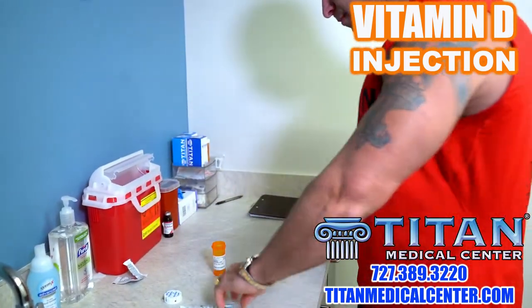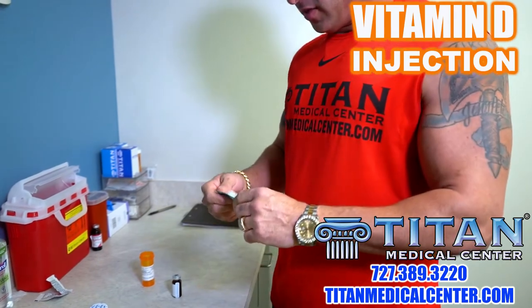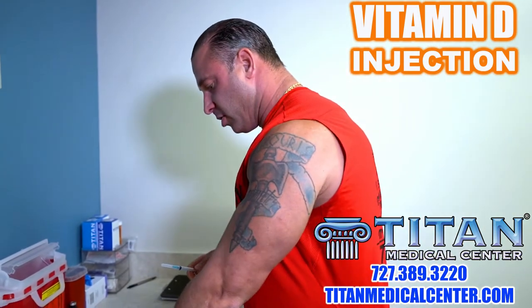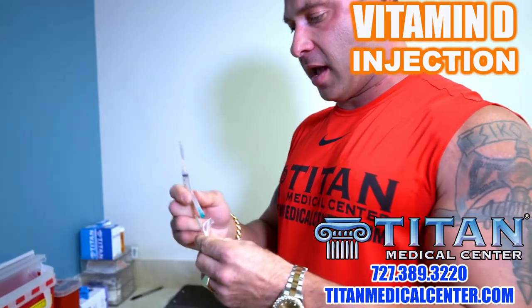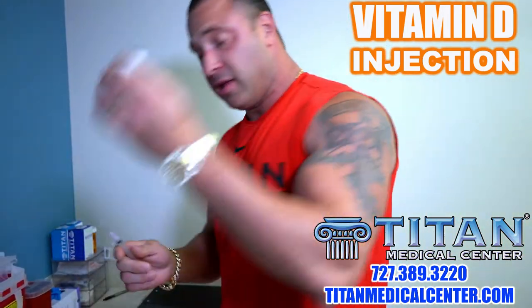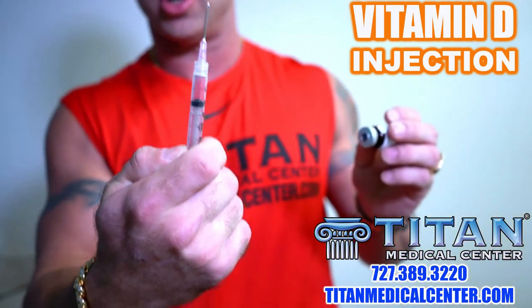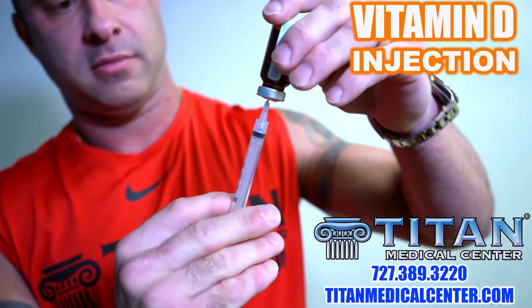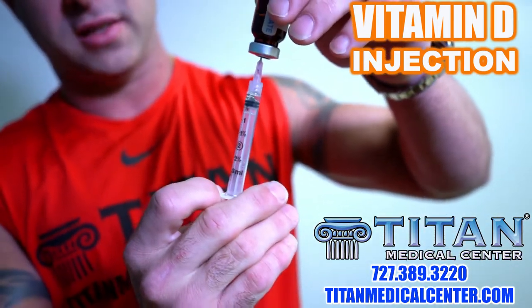Get that to the side and get our needle ready. With vitamin D the viscosity is a little thicker, so I've got another needle to put on here as a draw tip — it's going to let me get the medicine out a lot easier. We're going to decap this and pull down to 1 ml, which equals 50,000 IU. So per injection you get 50,000 IU of vitamin D. Push the air in to pressurize the bottle, then pull down nice and smooth.